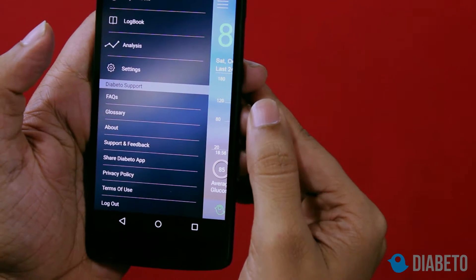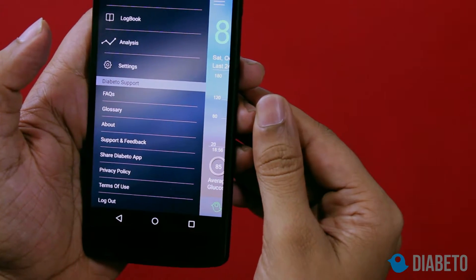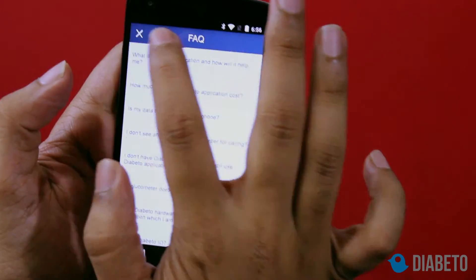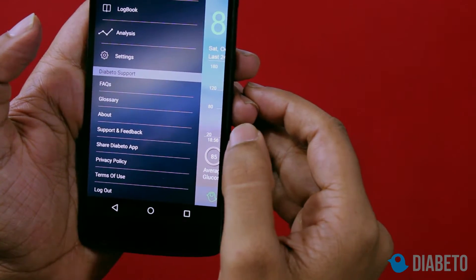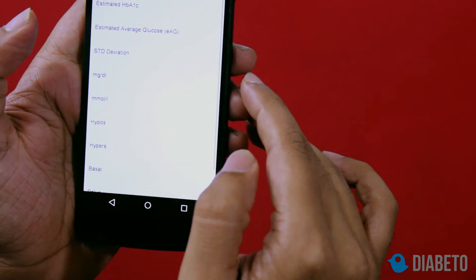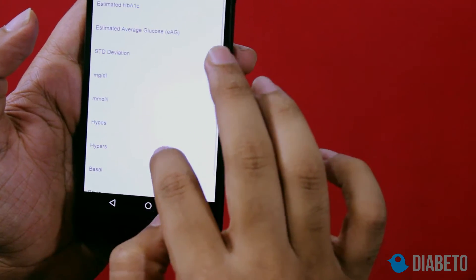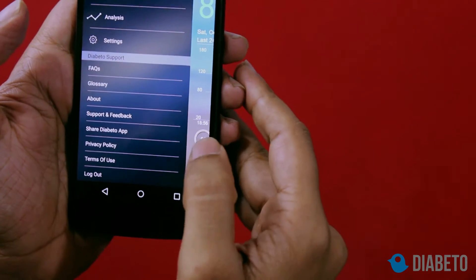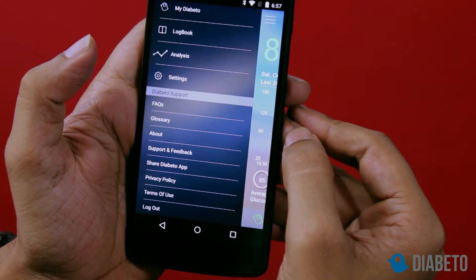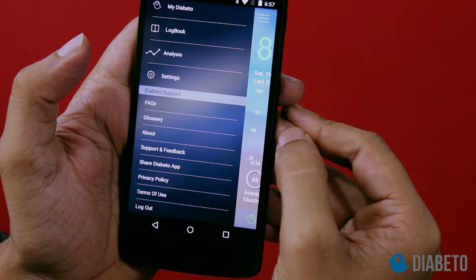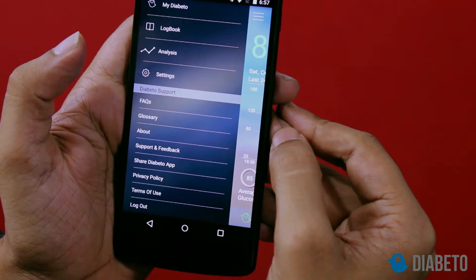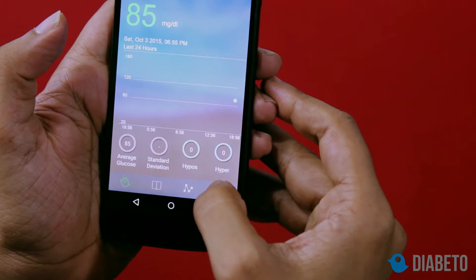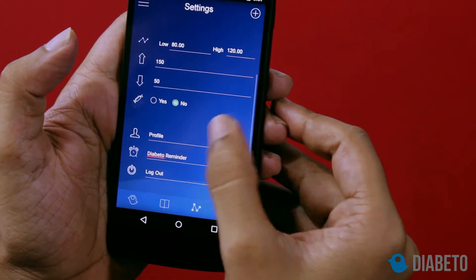This is the diabetes support panel, where you have fields such as FAQs — all the FAQs will be mentioned here. The glossary lists all the standardized terms used in the application. There is also support and feedback. You can share the Diabito application with your fellow diabetes friends, and you can log out whenever you want — the logout button is also in the settings screen.